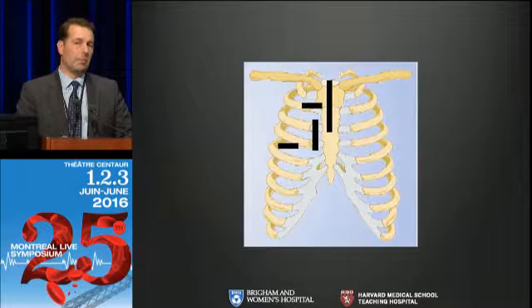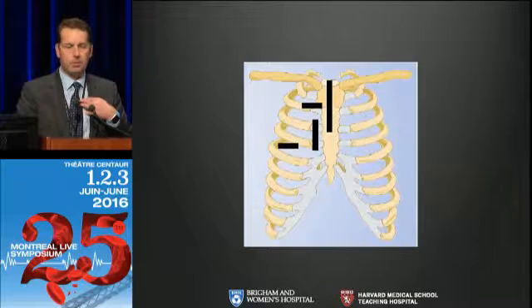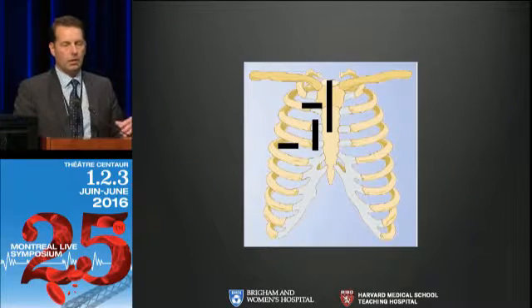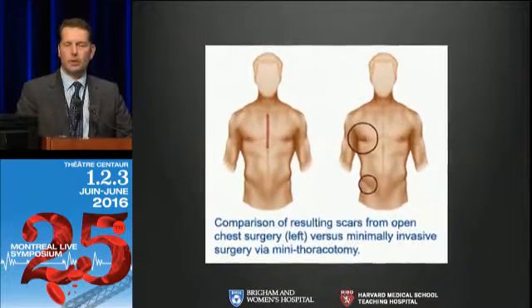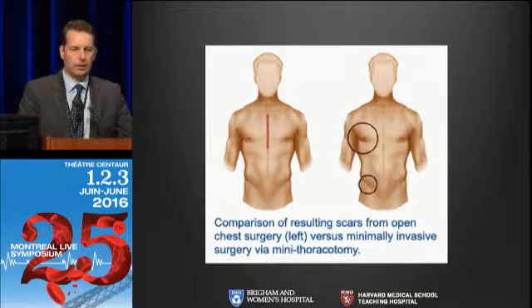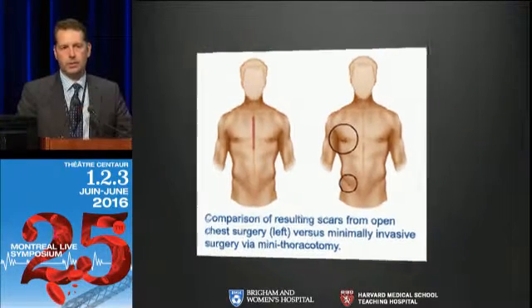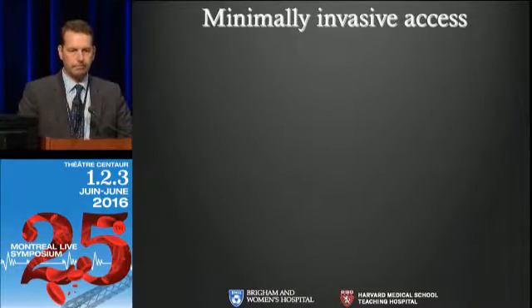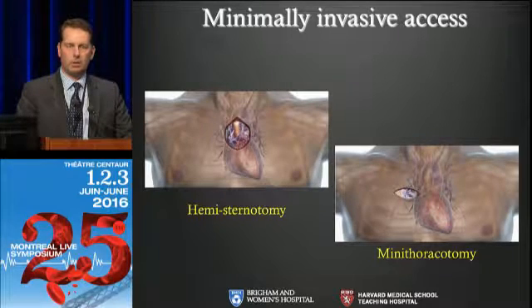There have been many different incisions that have been tried, whether it be a hemisternotomy through the upper part of the sternum, a parasternotomy, second intercostal space, or even something a little bit more lateral. And the two that are really maybe the most frequently used right now are the hemisternotomy and the second intercostal space. One of the big advantages is in terms of cosmetics, and I'll show you a couple pictures of that. And one of the other advantages is not going through the sternum and not having to deal with 6 weeks of bone healing.